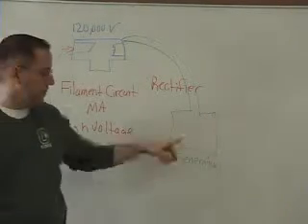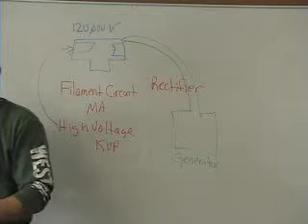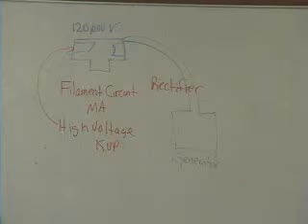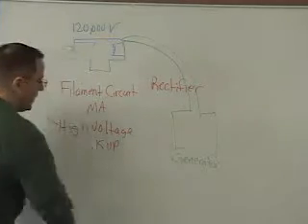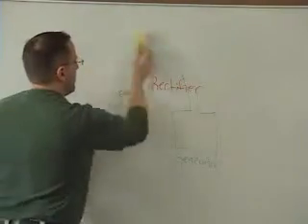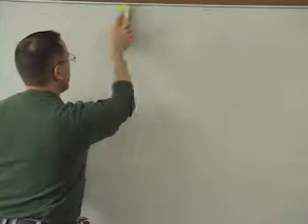The generator, there are different types of generators, and it's important to know what type of generator you have. In the office, most doctors' offices are going to have the weakest type of generator that there is. The stronger the generator, the more powerful the X-ray machine.